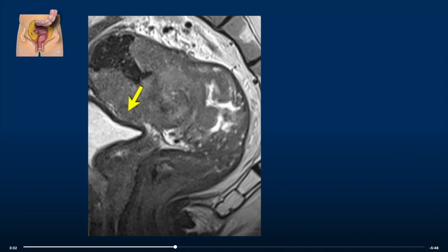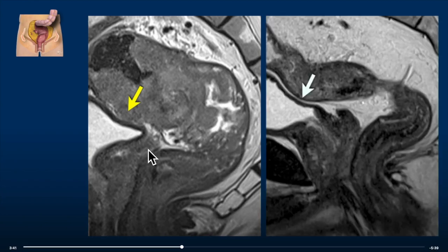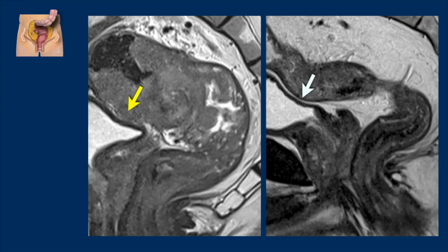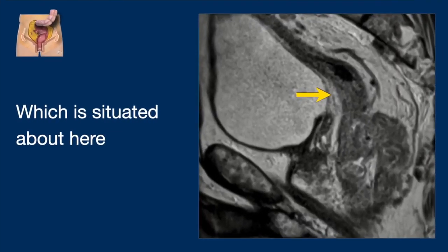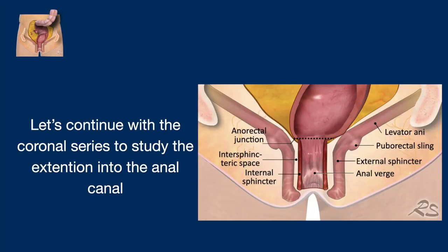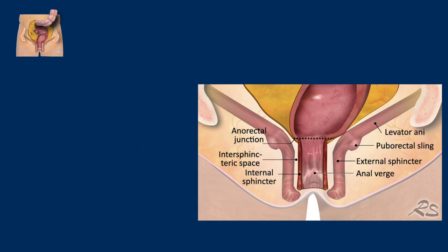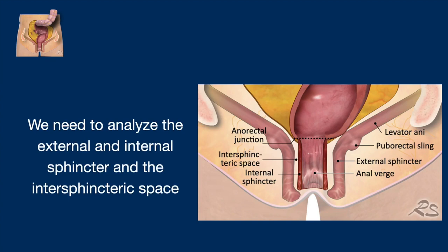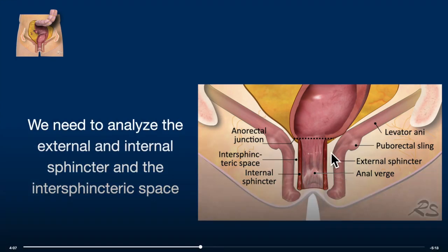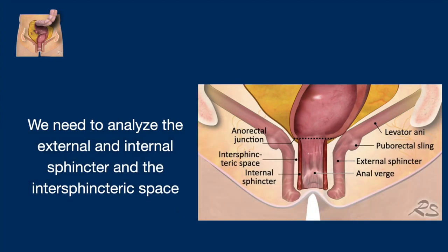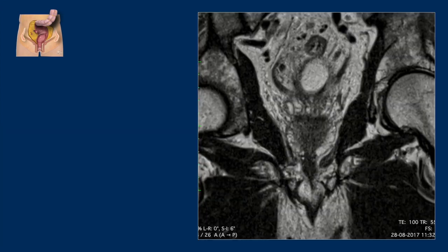In one case there is clear invasion of the peritoneal lining, while in another case the rectal wall is lying against the peritoneal lining but there is no invasion of the tumor beyond the rectal wall. Now let's go back to our case and continue with the coronal series to study the extension into the anal canal. We need to analyze the external and internal sphincter and the intersphincteric space, which is fatty tissue and bright on MR images.